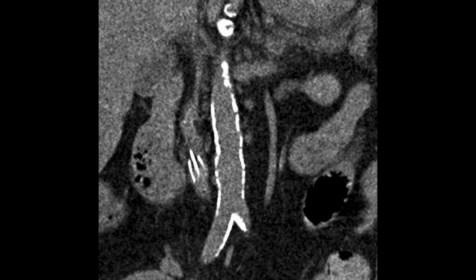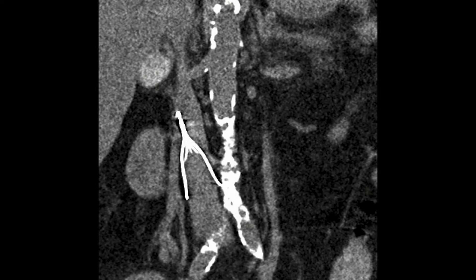Preoperative CT scan demonstrated an infrarenal IVC filter with no evidence of migration or fracture.